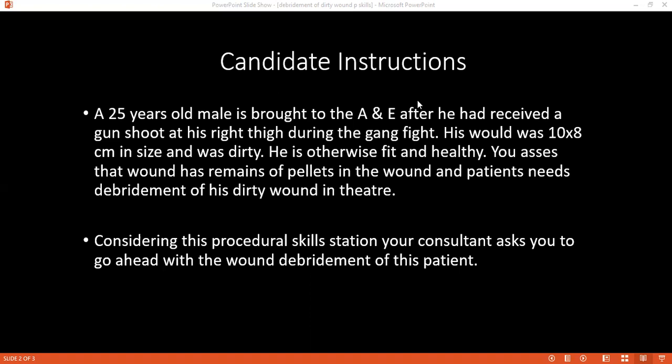Before that, I can take the pus tissue swab for culture and sensitivity also and send it to the laboratory. And before packing, I will remove the tourniquet and check for any bleeding. Is there any bleeding or not? Then I will pack the wound with negative suction. Then I will discard the sharps, blades, needles, etc. I have already removed the tourniquet.